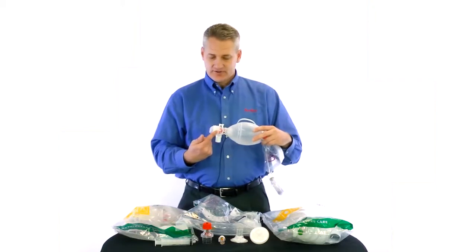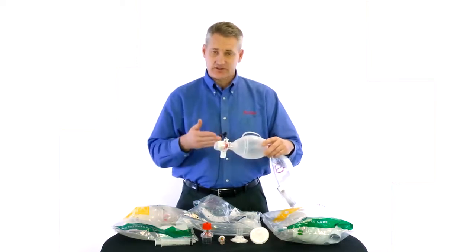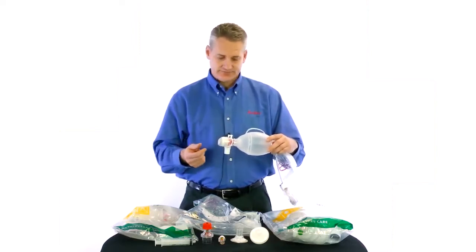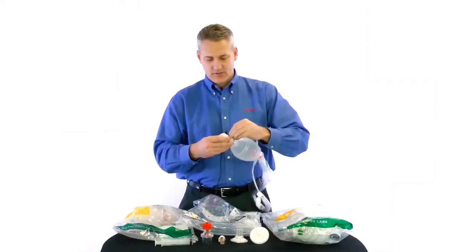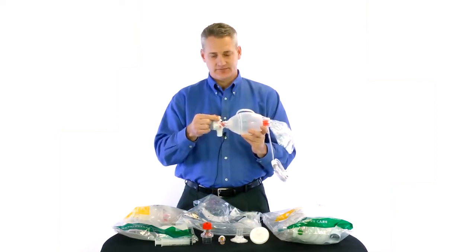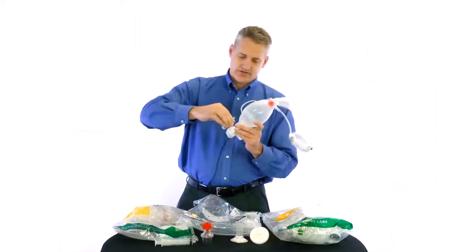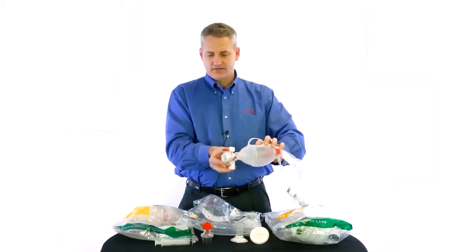Another feature on our pediatric resuscitator is our manometer port, which is standard on most pediatric resuscitators. Our manometer port follows the international ISO standards, so our connection here is not the same size as your standard O2 inlet connection. We have added an extra adapter so that if you need to connect a wall-mounted manometer, you can attach that and then hook your oxygen tubing right there. If you are using a disposable manometer, like our Ambu disposable manometer, that will just screw right on, and as you give breaths, you can see how that pops off.